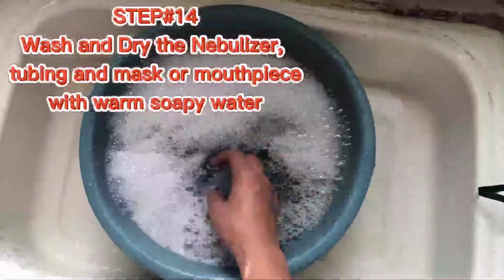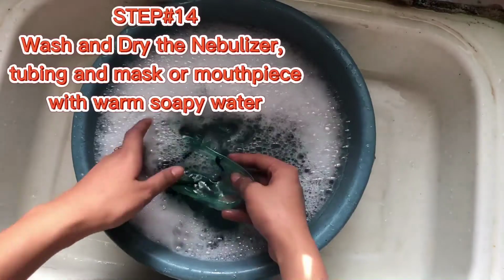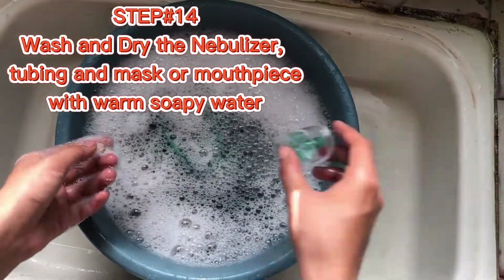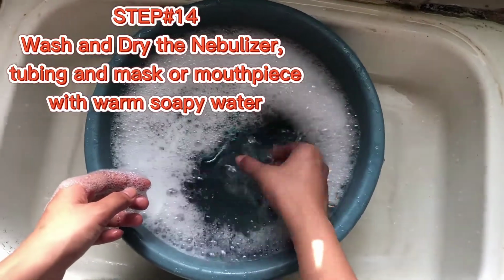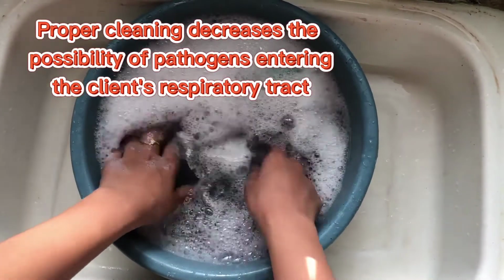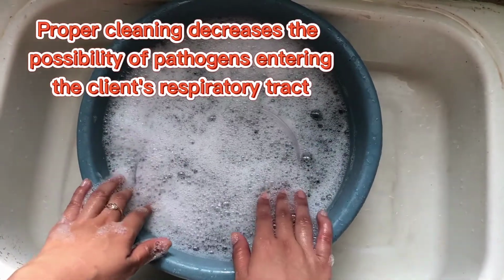Step number 14. Wash and dry the nebulizer, tubing, and mask or mouthpiece with warm, soapy water. Proper cleaning decreases the possibility of pathogens entering the client's respiratory tract.